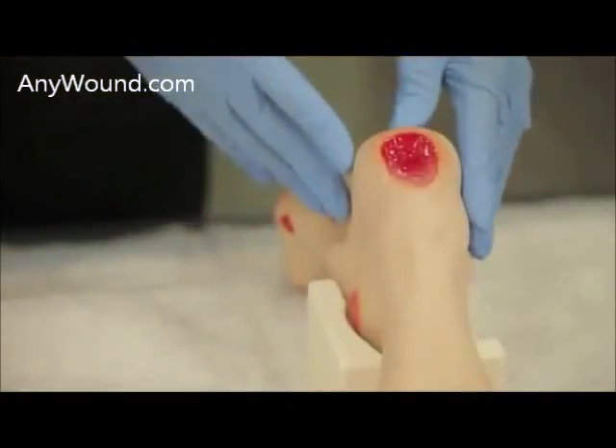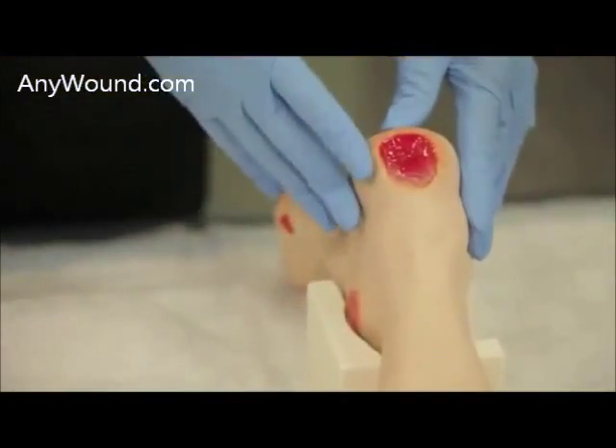My name is Vicki Kishnick and this is a demonstration of the application of Enluxra on a diabetic foot ulcer, specifically a heel wound.